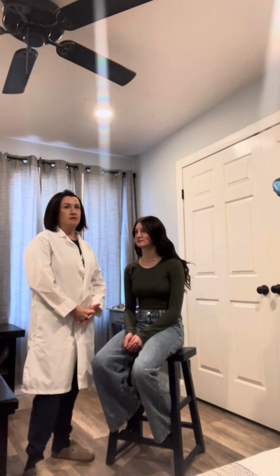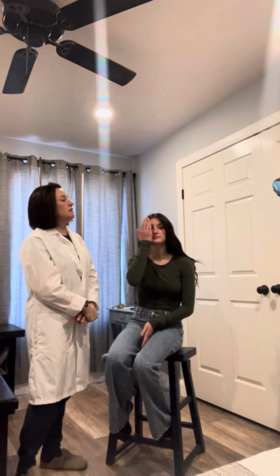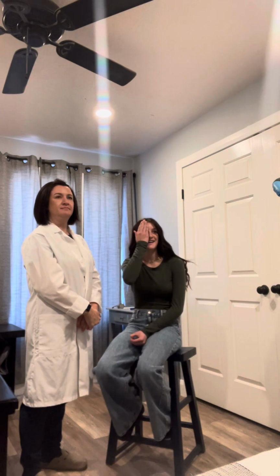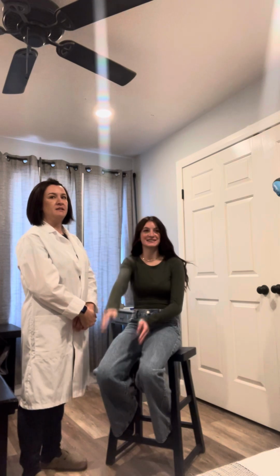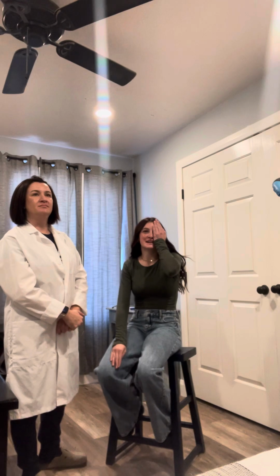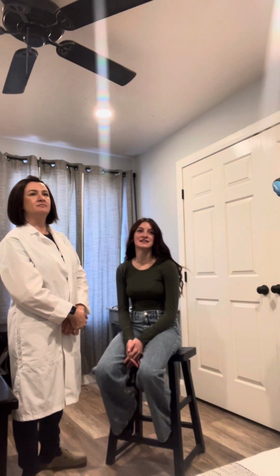We'll start by assessing cranial nerve number 2, which is with my Snellen chart over there on the wall. So cover one of your eyes and read the bottom line. O T F P H. Okay, now switch. L T F P H. Okay, now read it backwards with both eyes. H P F T L.